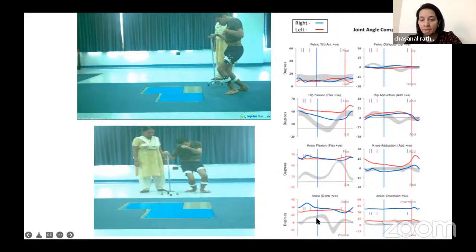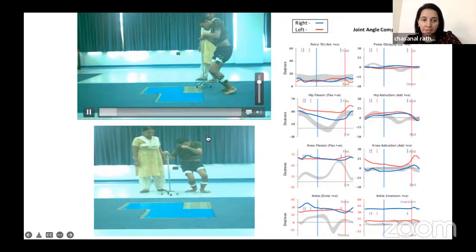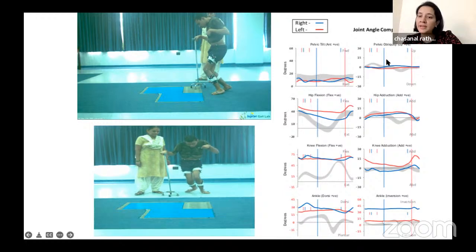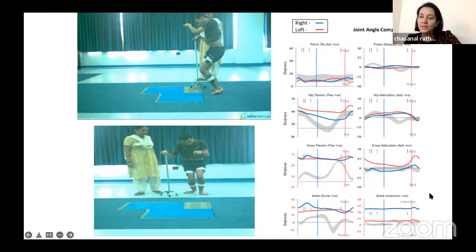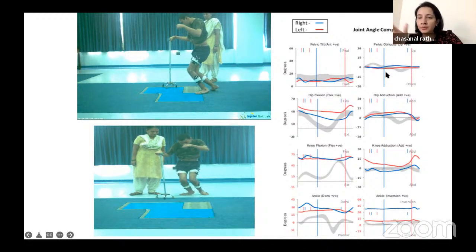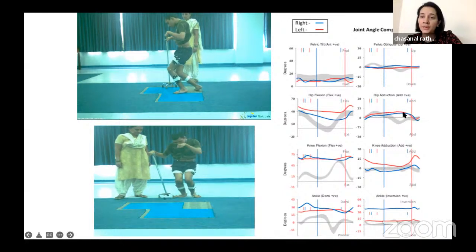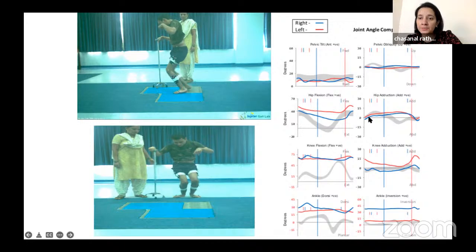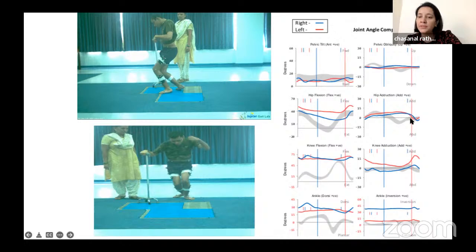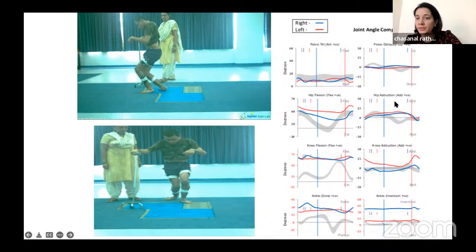So these are the sagittal graphs, and now these are the coronal graphs. If we look at this one, now we need to have a coronal video if we want to see the second set of graphs in our report. So we see the pelvic obliquity, yes, it is not too much obliquity in the coronal plane, but yes, there is a hip adduction, abduction, which is happening. So you see the hips are constantly adducted, while they should have been abducting at one point somewhere in the swing, they are not. And if you see, both the legs have different stance and swing phases.